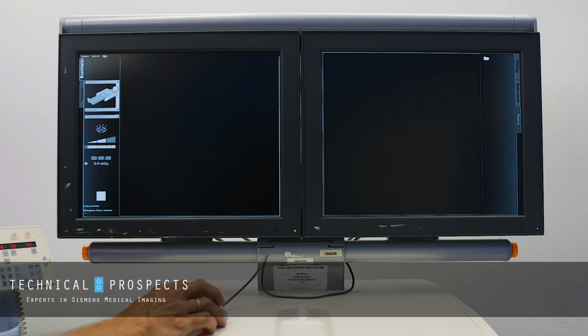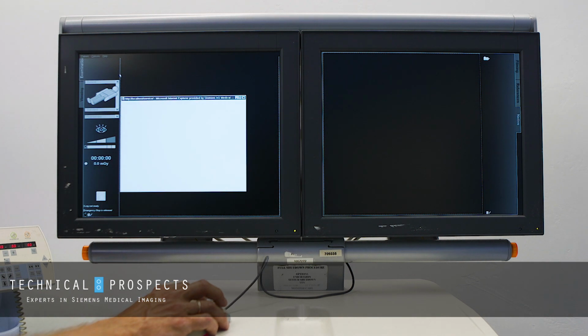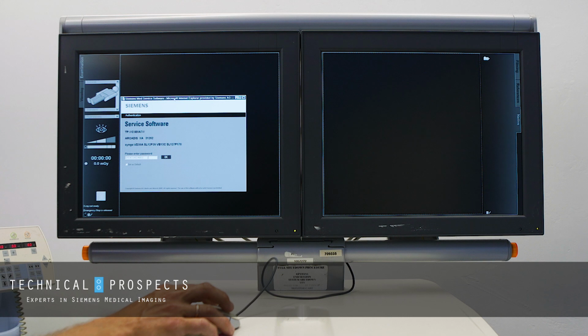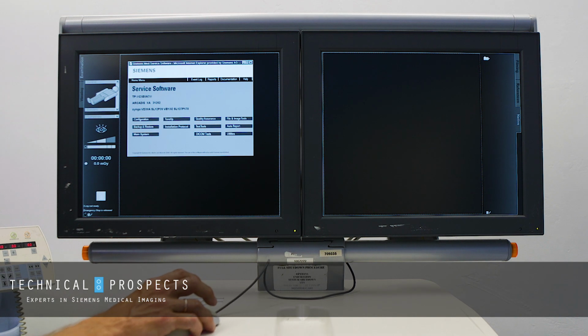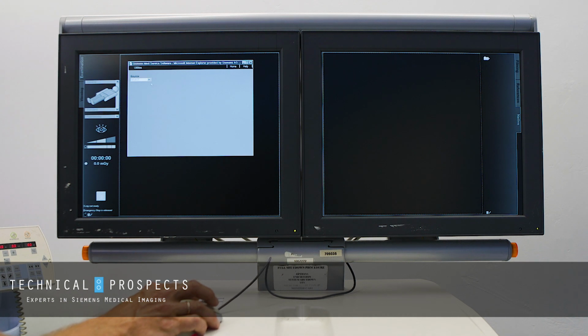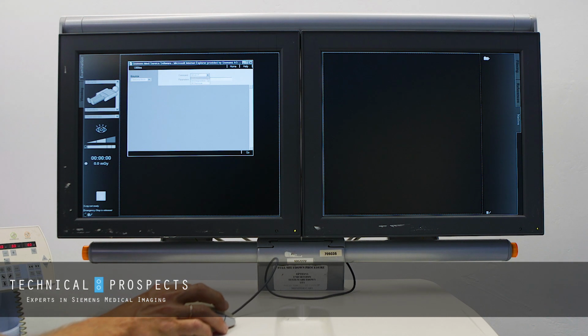To delete a database, we just need to click on Options, Service, Local Service, put in the last 6 of the service password, which you should have in your login screen. After you see the service software running, you go to Utilities, go to Database Tools, and you select Remove the database.